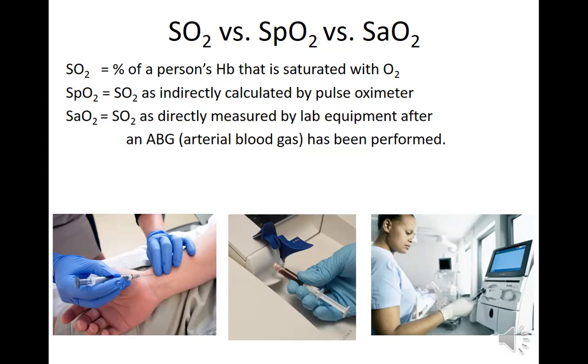Arterial blood gas is more invasive. So you have to poke somebody, of course, and you're only getting a moment in time when you're doing the arterial blood gas. You're not monitoring. You can't keep monitoring by keep poking, right? So SO2 is what we agreed on.